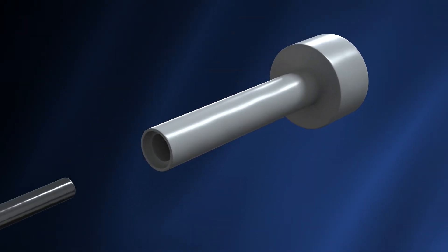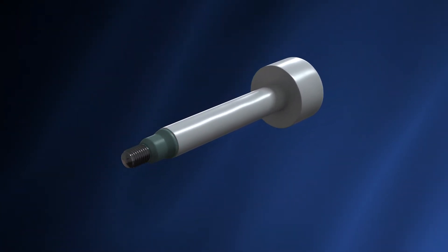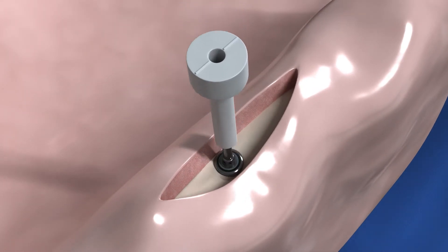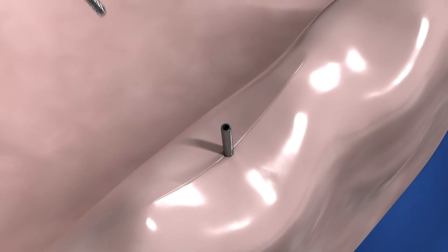Secure the Pathfinder to the implant immediately after implantation and before suturing. Suture the soft tissue and use a transmetal burr to remove the excess height of the irrigation tunnel, right above the mucosa.